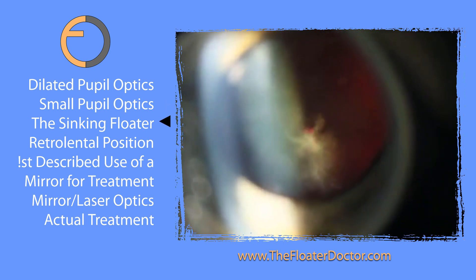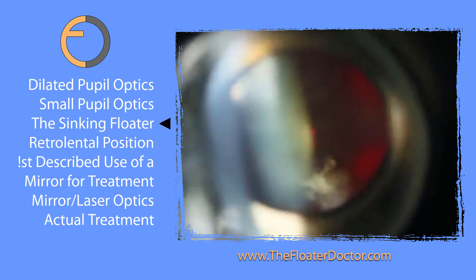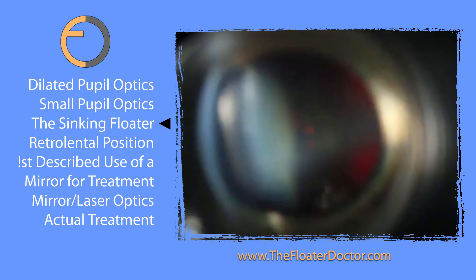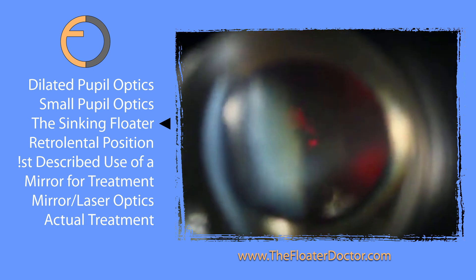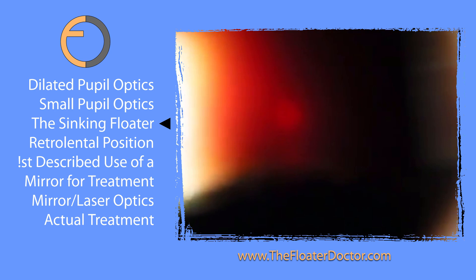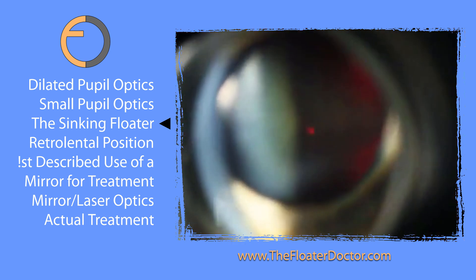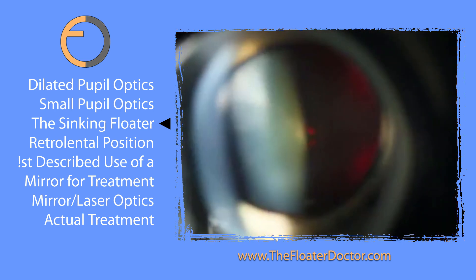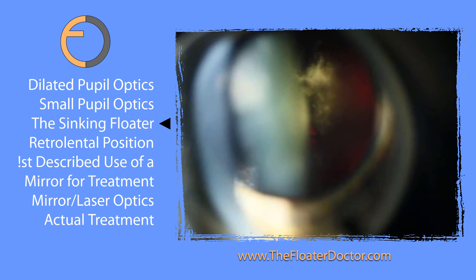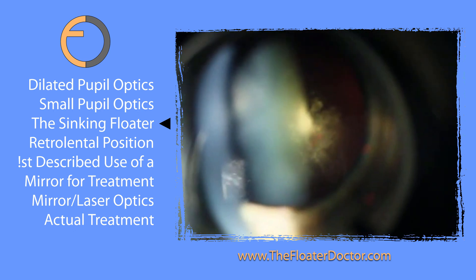As we switch back to live action again, you can have a better appreciation for the dynamics and the movement of this floater. I'm used to chasing after moving floaters, but the problem with this one in particular is that it floats very, very close to the lens.